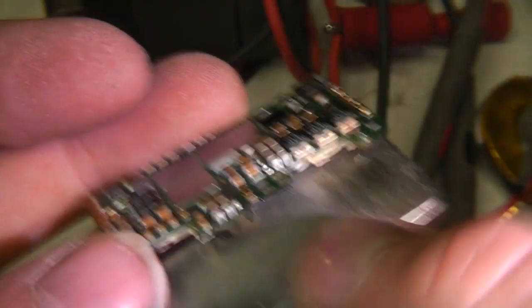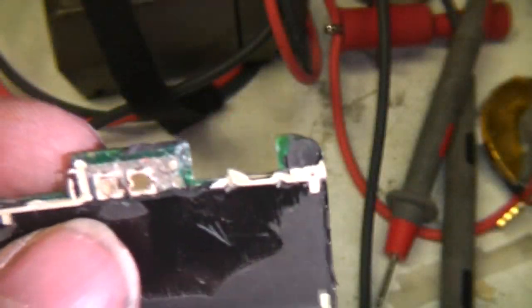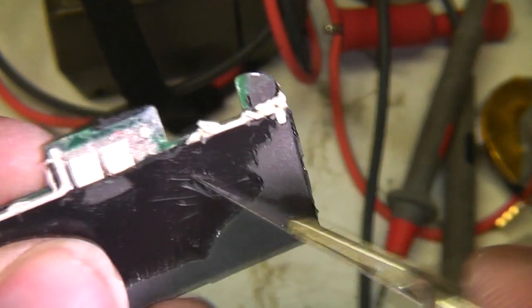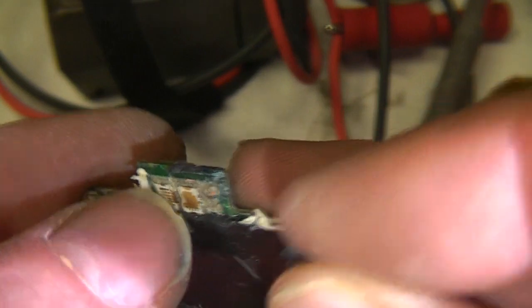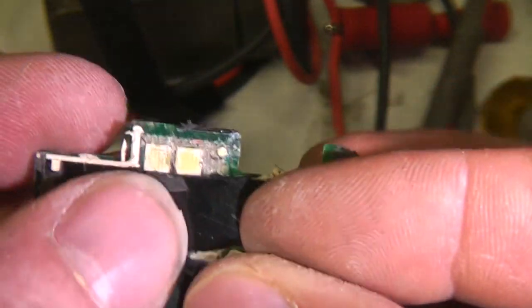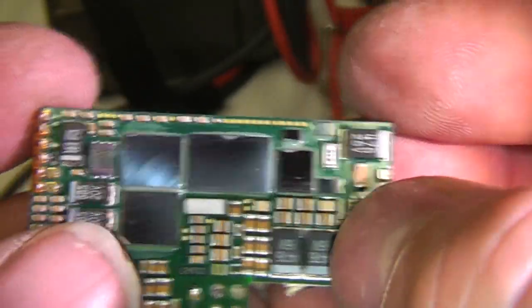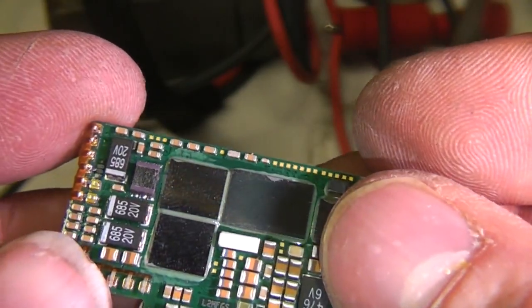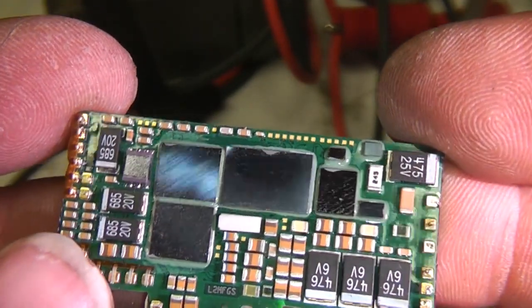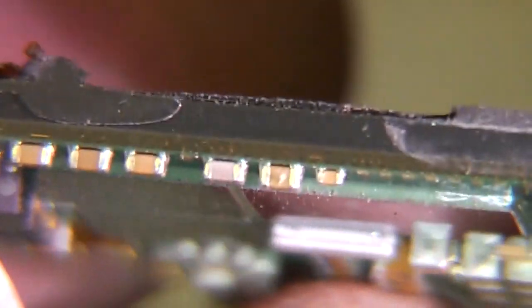Right, I managed to peel the battery off this PCB. Unfortunately the back side is potted in some pretty hard potting compound, so it's going to struggle to do anything. I just peeled this back a little bit and it's peeled off another couple of large silicon devices. I can imagine that some of these are probably high voltage power devices, hence the large size. And the PCB itself has, I'd imagine, probably 6 to 8 layers.